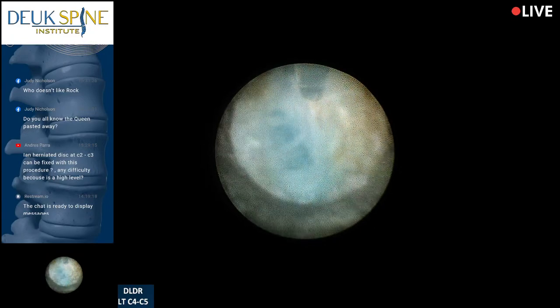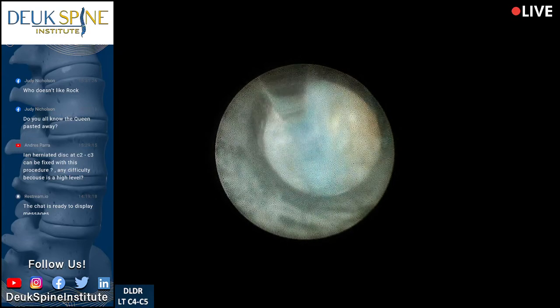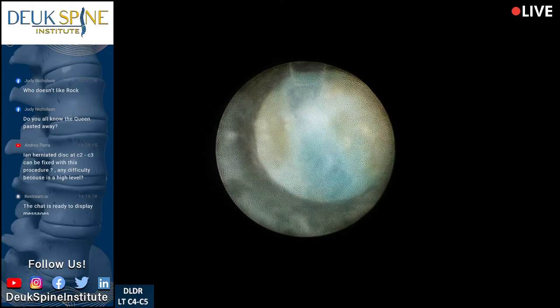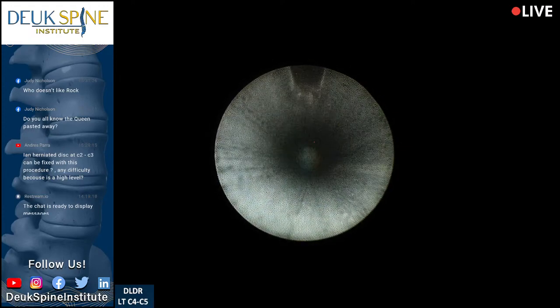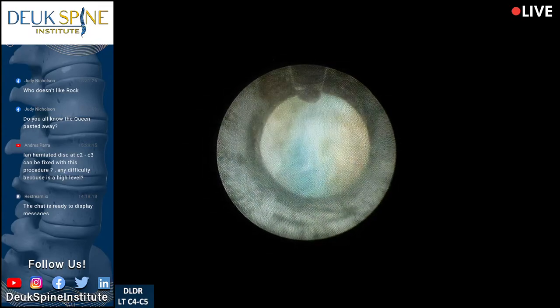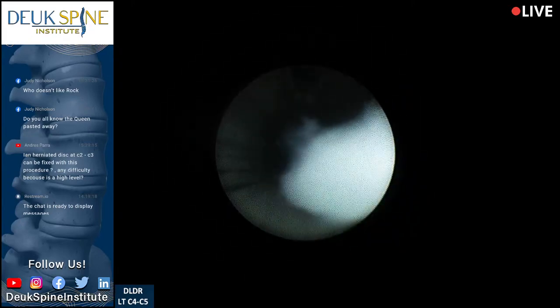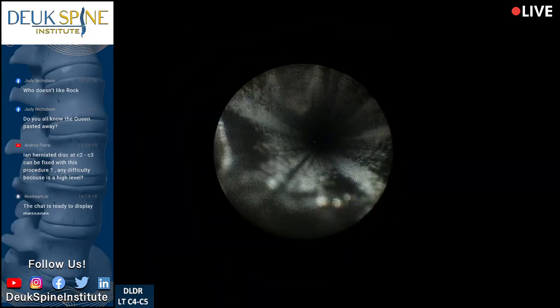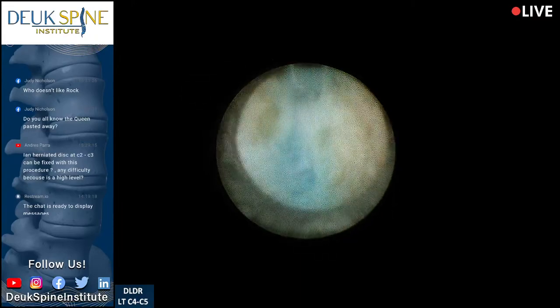Just working away here. The Duke Laser Disc Repair does a removal of the herniation and cleans up the annular tear — that's what I'm working on right now. We've had two large pieces of herniation so far. I'm going to pull back a little and look over to the patient's right — there's another one. If you have any questions, type them up — that's why we do live stream, so you can ask questions during surgery.